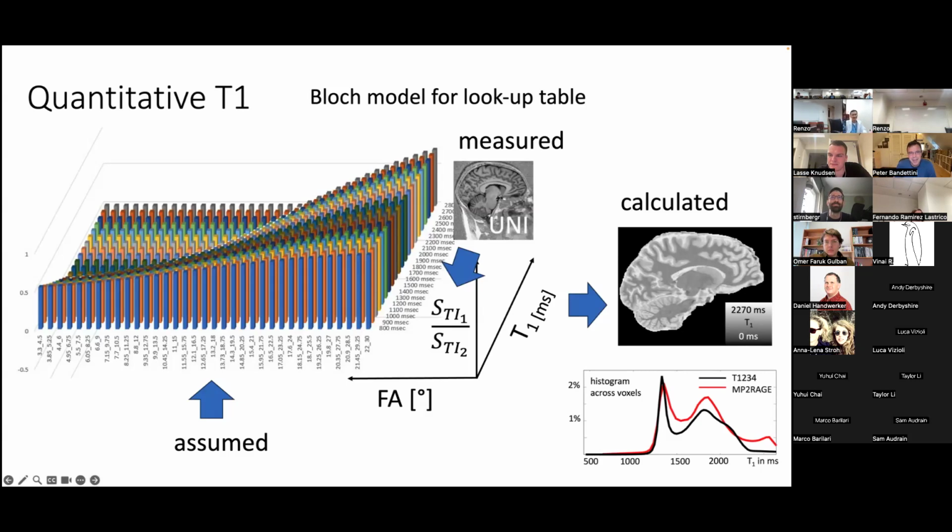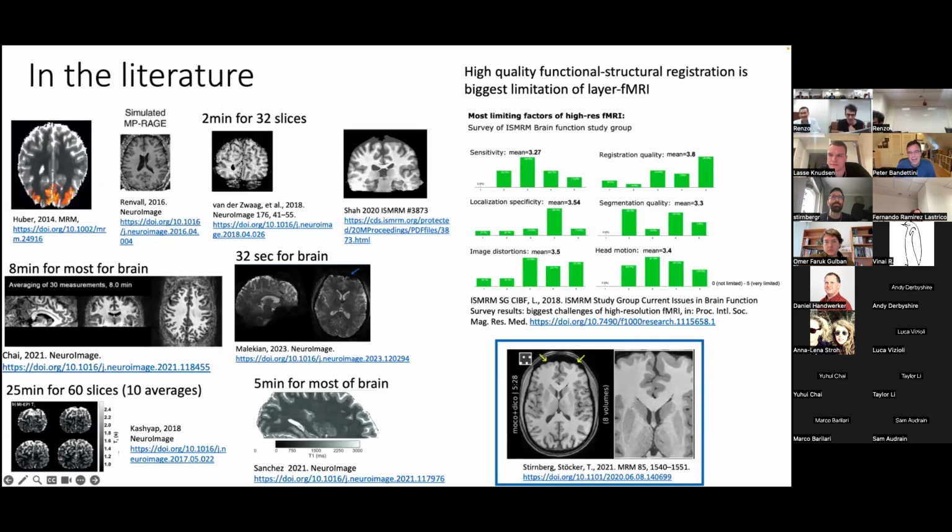Maybe I can talk a bit about the history, the first point. We do mention that there are many studies before that tried it. I think MGH, who did it for layer fMRI, also after us, they never used it, right? Unclear. I think the EPI just never looks good enough to be pushed through FreeSurfer, and distortions come along with thin voxel dephasing, and FreeSurfer is still kind of choking on that partly. So maybe we need to make it clearer why those studies are not used, why they haven't caught on.